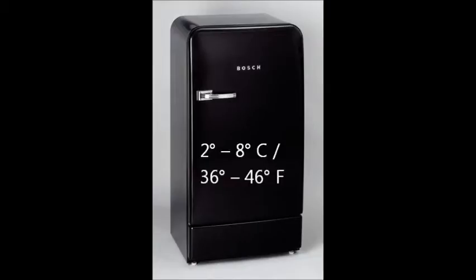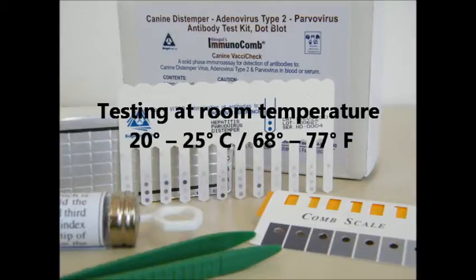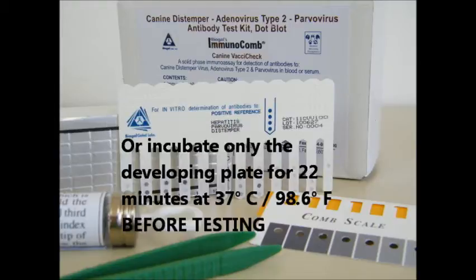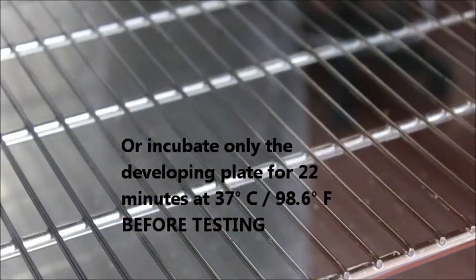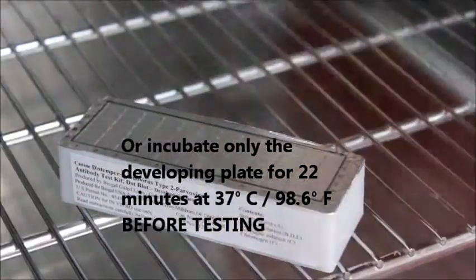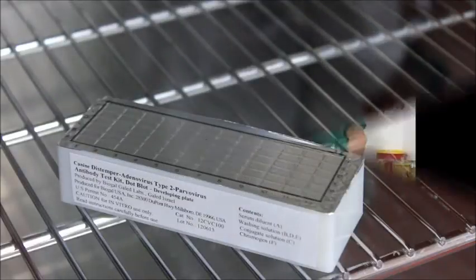Before conducting the test, ensure that all the kit elements and the specimen to be tested are at room temperature for at least 60 to 120 minutes before you actually test. You can speed up this process if you incubate only the developing plate for 22 minutes at 37 degrees Celsius or 98.6 degrees Fahrenheit.